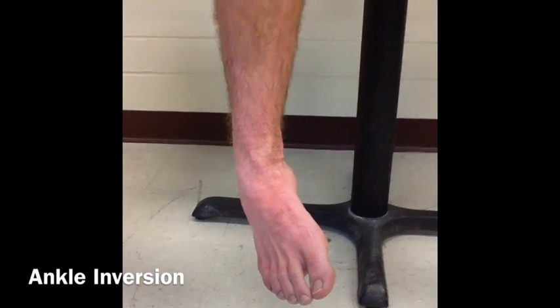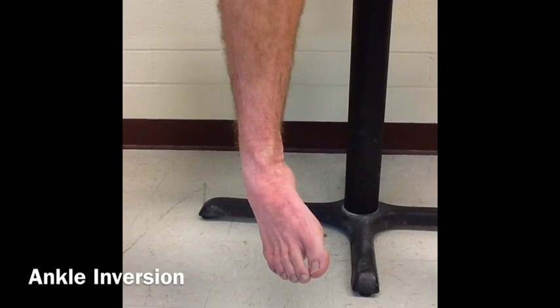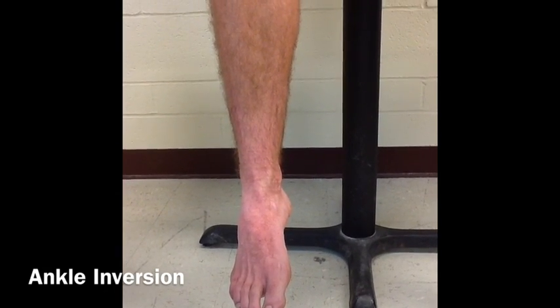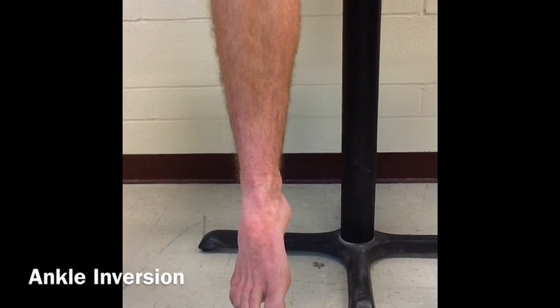The result is 48 degrees. Our patient has 48 degrees range of motion, which is slightly hypermobile, seeing as the normal range of motion for inversion is 35 to 45 degrees.